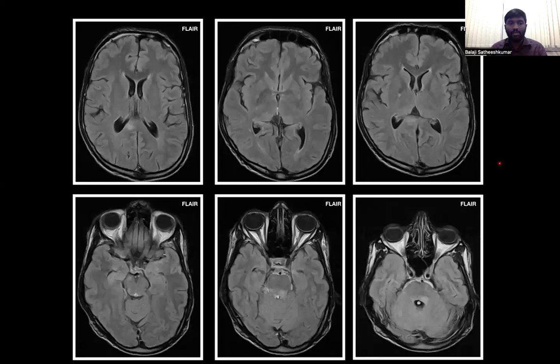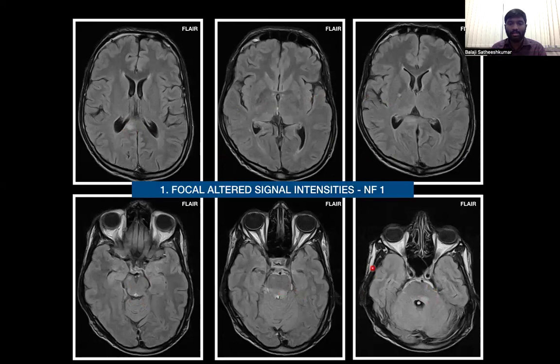Moving on to the first case, we see multiple areas of FLAIR hyperintense signal involving the splenium of corpus callosum on the right side, bilateral gangliocapsular regions, midbrain on the right side, and periventricular area of pons. This is a case of focal altered signal intensity in neurofibromatosis 1.